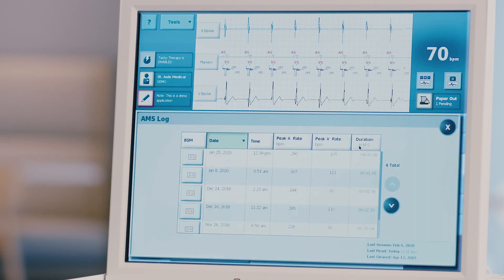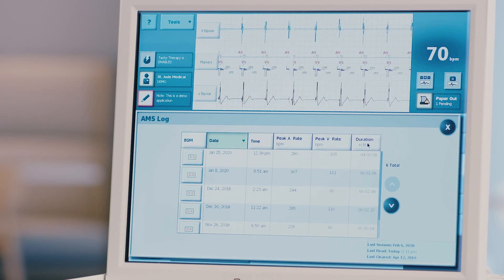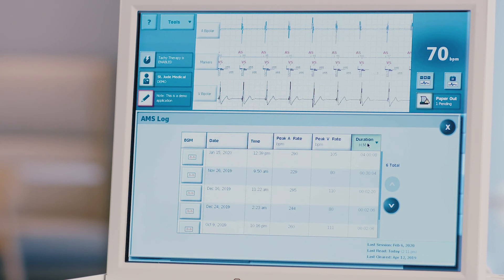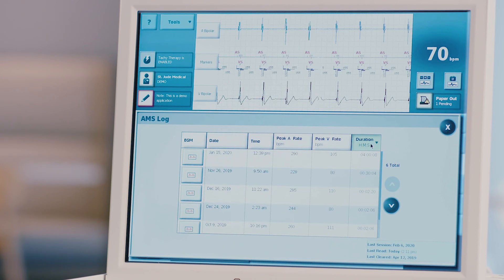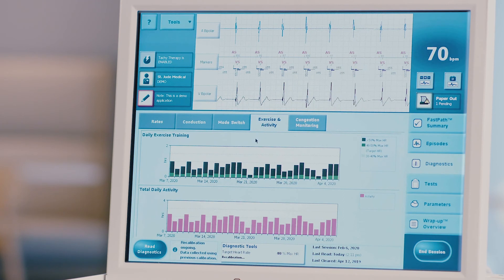The AMS log contains five columns: date, time, peak rate, duration, and EGM availability. To change the sort order of any of these columns, select the button at the top of the desired column. Sorting by duration is recommended to allow easy determination of the longest and shortest episode. Press the exercise activity tab at the top of the screen to evaluate the patient's activity levels if necessary.